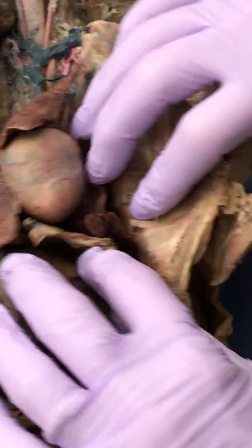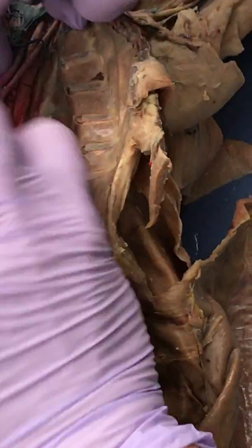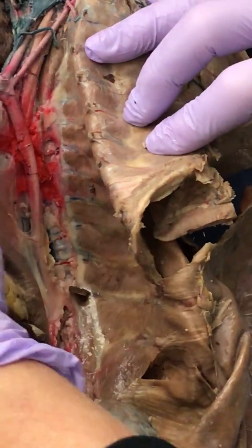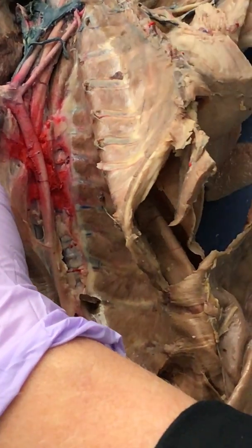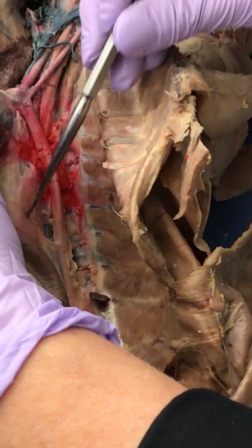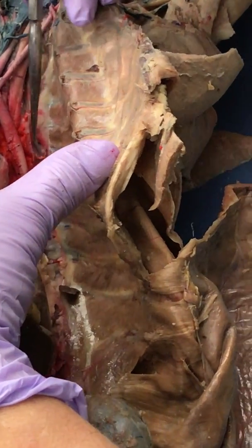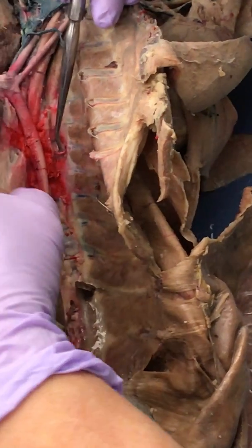And then most of the time we roll to the left, because the left gives us that really great view of the aorta and the esophagus. Yeah. So most of the time we spend with this view. And you can see the aorta coming down. There's the esophagus. All right, the little arteries that are coming off of the aorta to do the ribs are called intercostals.